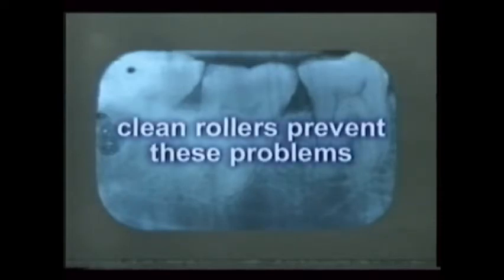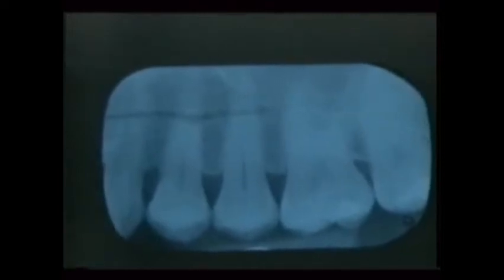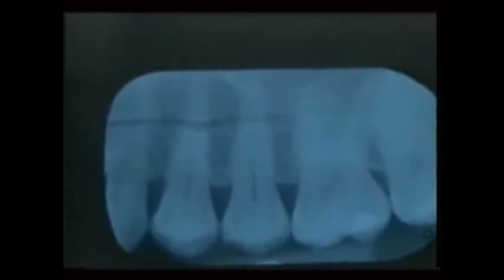If an automatic processor has dirty rollers, dark bands may be seen on the film, and overlapping can also happen as a result, even if the films are properly loaded. Only proper machine maintenance and clean rollers can prevent these problems. White lines on or across the film may be due to fingernail scratches. Dark lines are usually the result of creasing the film when bending it into place.